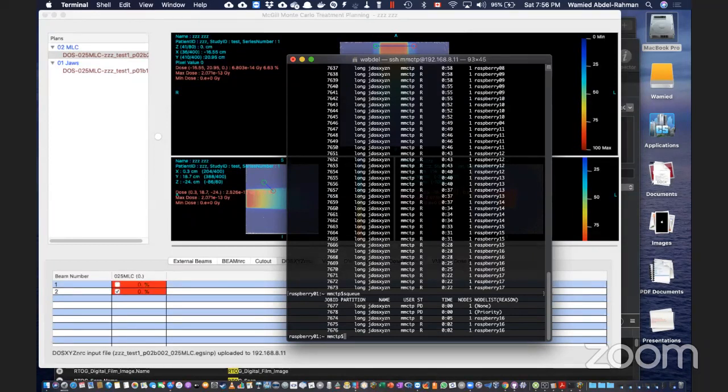But you have the body as a structure, right? True, but Eclipse generated it. You need to assign CT numbers, and then the exported DICOM should have the CT numbers. It's like a patient. I had a problem in that part, and maybe I should revisit it. Andrew, if you were able to import that DICOM export from Eclipse into MMCTP, I think there is potentially a problem, because maybe it did not export DICOM images, only DICOM structures.